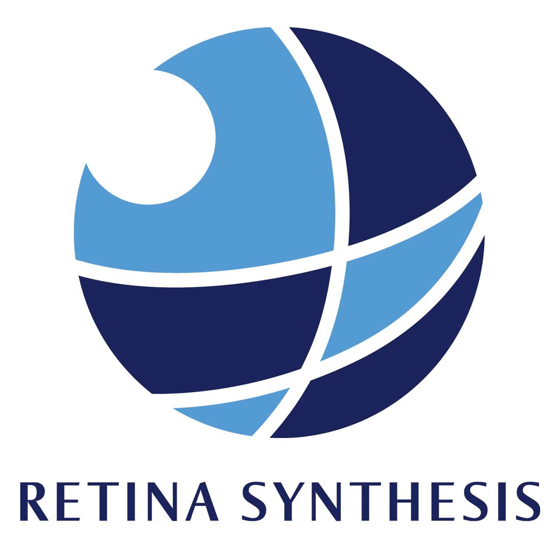And then as you follow that along, the individual drusen becomes atrophic, and then multiple drusen become atrophic, and the individual areas grow and enlarge. And you can image the emergence of geographic atrophy using en face imaging, just like you would follow fluorescein angiography or later stage atrophy with autofluorescence. But the remarkable thing about en face OCT is if you try to see these changes on autofluorescence or infrared reflectance, these early changes just aren't present. You can only see them with en face OCT imaging.